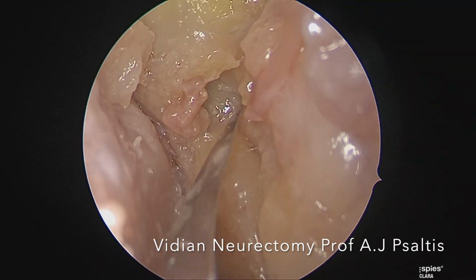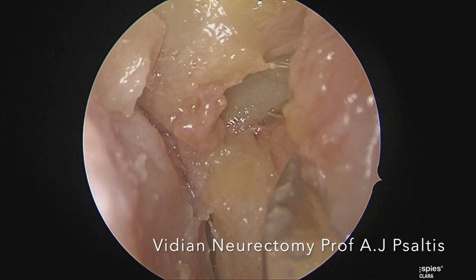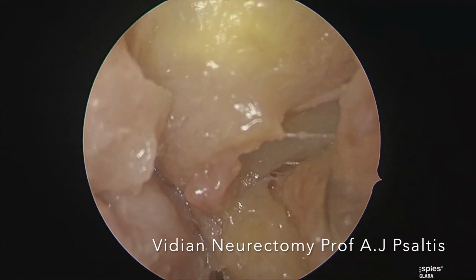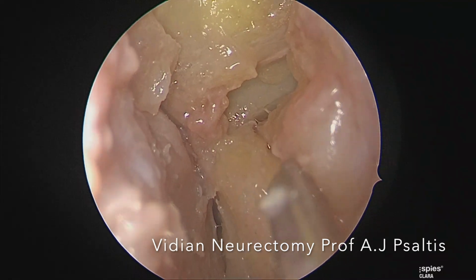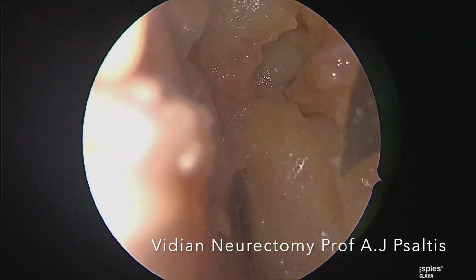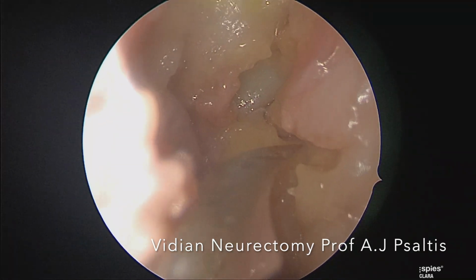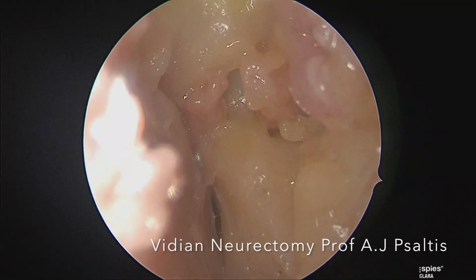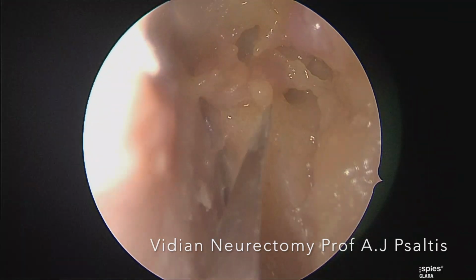Here we can see that now that the posterior nasal nerve has been sectioned, we can use the sickle knife to develop the superior border of the Vidian canal. We can then use a sickle knife to develop the inferior border of the Vidian canal, and here we can see tension of the Vidian nerve within the canal. When performing a Vidian neurectomy, it is important to gain 360-degree access around the entire nerve.